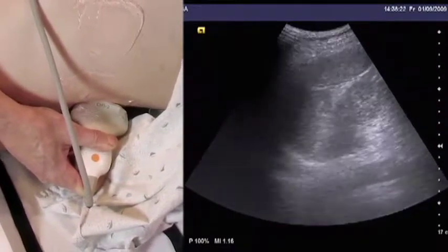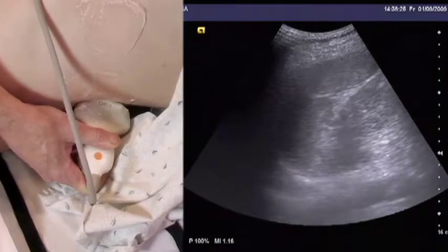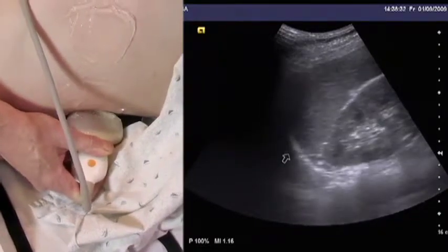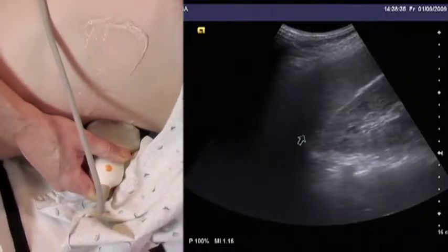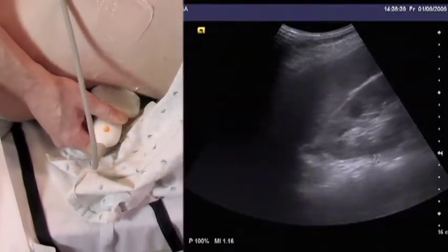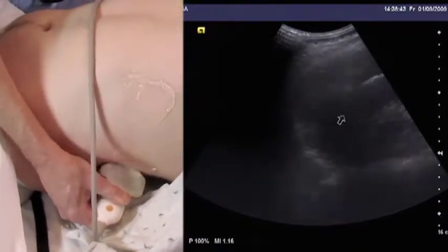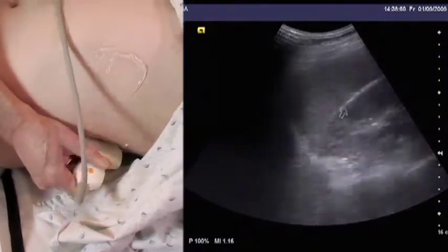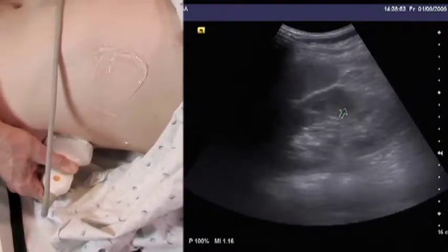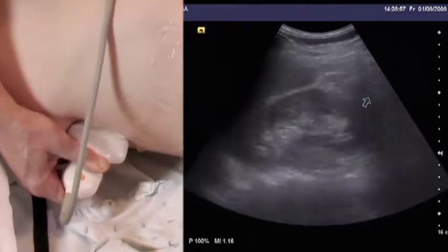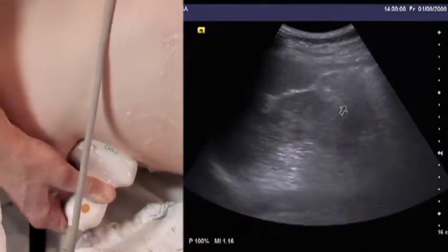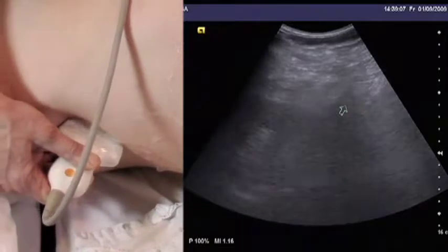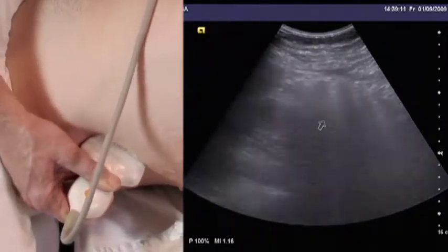This view tends to be more superficial, and oftentimes we can zoom in a little bit to make use of all our visual real estate on the screen. The four spaces we're checking are: the pleural space, the subphrenic space right on the inferior side of the diaphragm, the splenorenal space — which is the analog of Morrison's pouch — and we stay off the ribs as we scan through all tissue planes. Going over another rib space, the image goes dark as we pass the rib, and we can check the inferior pole of the kidney — we may need to go down one more rib space to really reach it. There's no fluid seen here.